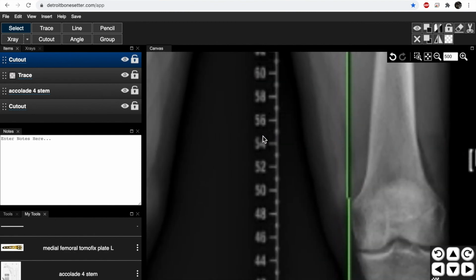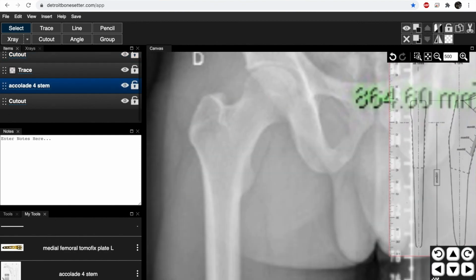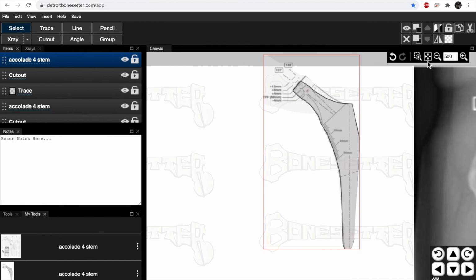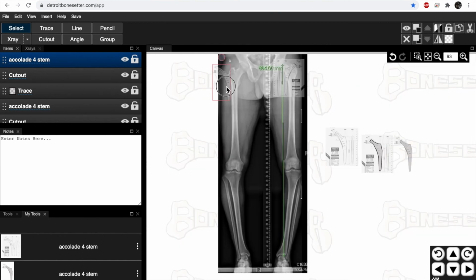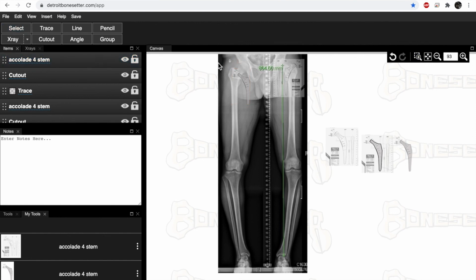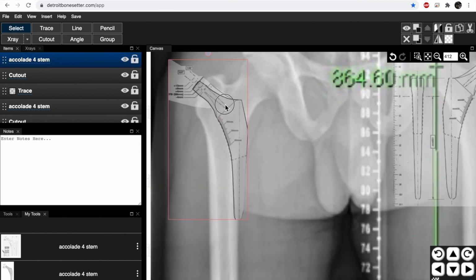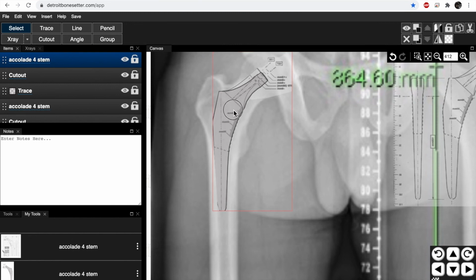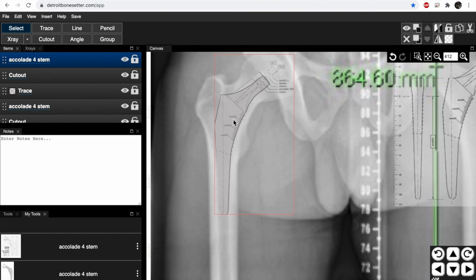Now I can come back to my femur, remove this stuff, and I can add my stem. Here it is, Accolade stem. There it is. Let's make this a little bit bigger. You can see my stem is here. I've included these pieces. I can reverse it. I can bring it in, and it's actually quite good. I can make it even more transparent if you want to see right through it, see how it fits. There you go. And that's how I save a template.